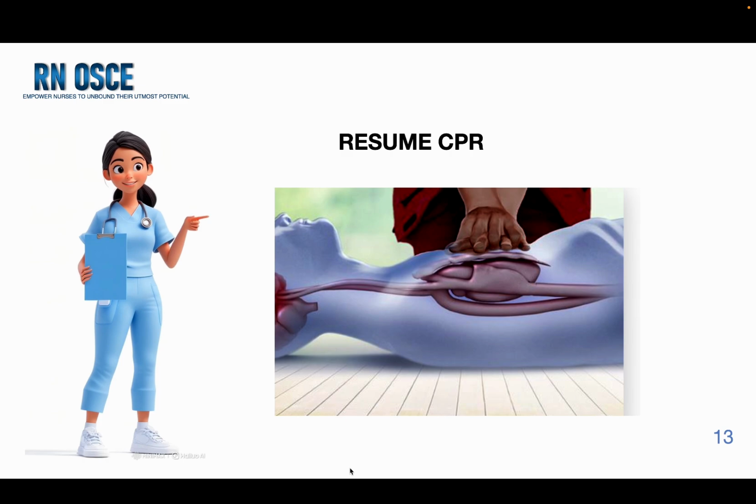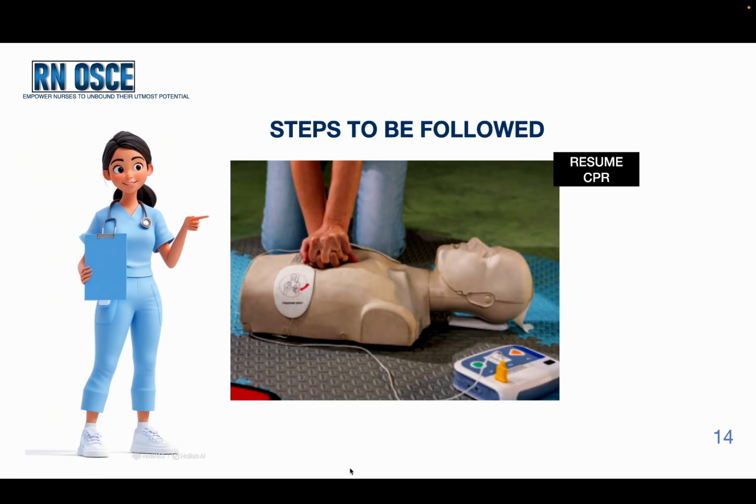The AED advises shock, which is delivered immediately without any delay. You can resume the CPR. If the AED advises no shock required, it could be a non-shockable rhythm. Also resume CPR without any delay.